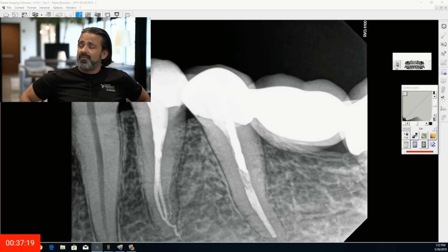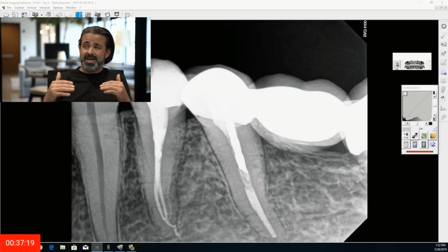And so I've gotten a lot more trust with the fluid than, you know, I guess when I got exposed to the technology, I was hoping that this would be the case. But it was really comforting to find out that it actually is that way during the case. In summary, we had a nice technique to show you the platform build. Took me a while to kind of master that, to get my workflow down and be really fast and efficient and try to get that perfect pass the first time. So hopefully those techniques help you learn from my trials and errors.